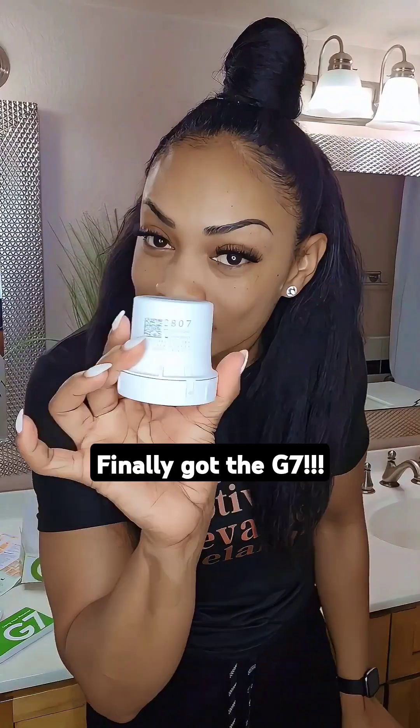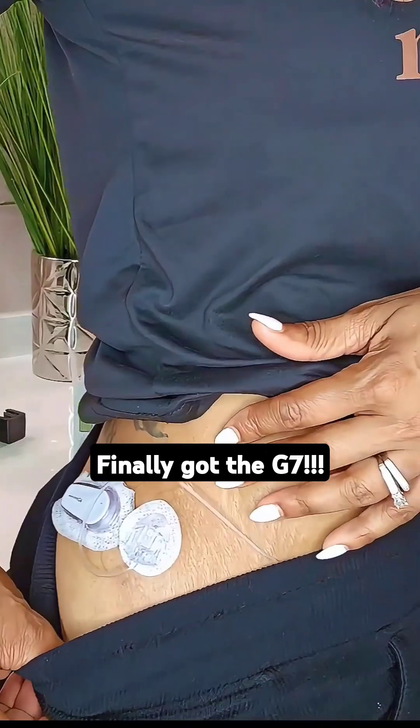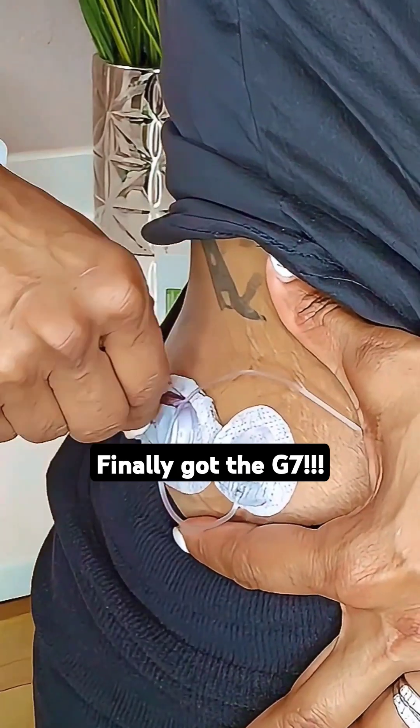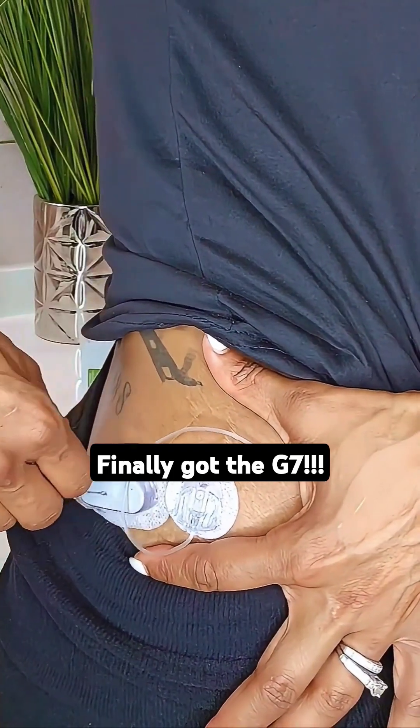Make sure I'm doing this right, cause listen, we can't afford to waste no sensor. This is the Spanish side. Now before I insert the G7, I gotta remove the G6. I got double action — it's the insulin pump, so I won't be taking that out.